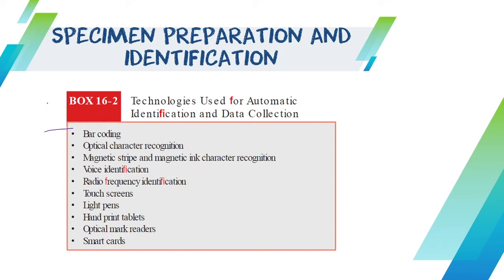Because it makes all the processes easier, there are fewer or minimal problems in terms of labeling errors. Since everything is already encoded in the computer, even the tests to be undergone, there is a very minimal chance that a test will be overlooked. So again, everything is encoded. All you need to do is scan that barcode and let the computer or the auto analyzers do their job.